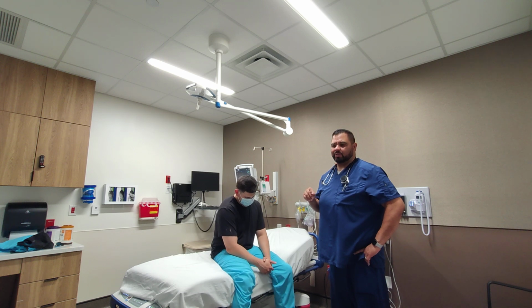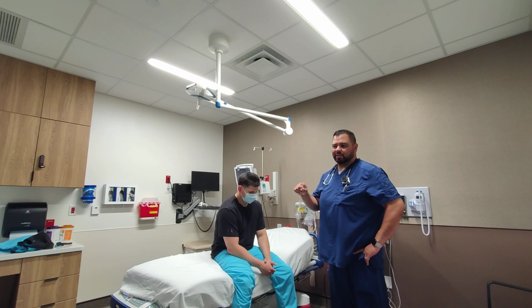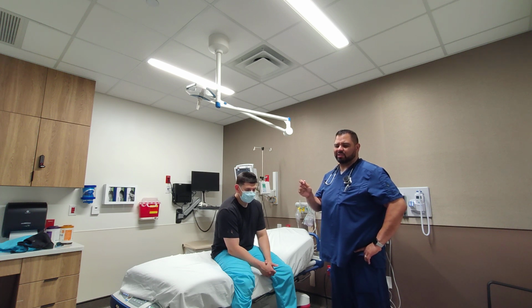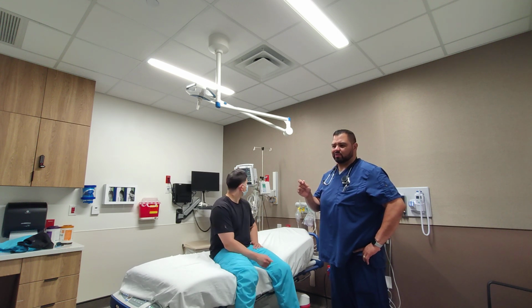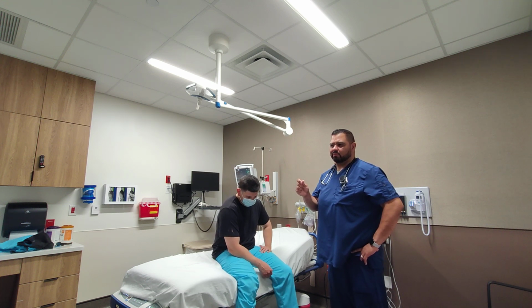And after we do that, we'll actually take the appropriate size speculum. We'll insert it, turn it clockwise, and open it until we can see the cervix. Then we'll lock it in place, and we will observe the cervix, the os. Make sure that there's no redness, any inflammation. Any drainage could indicate some kind of bacterial vaginosis or candidiasis. Look for any kind of abnormalities with the vagina.